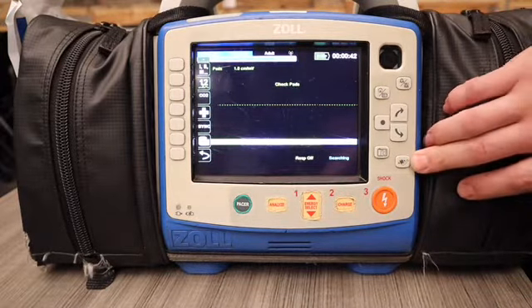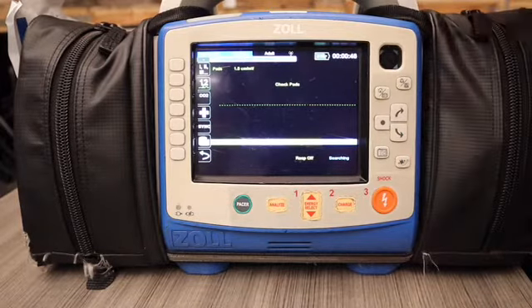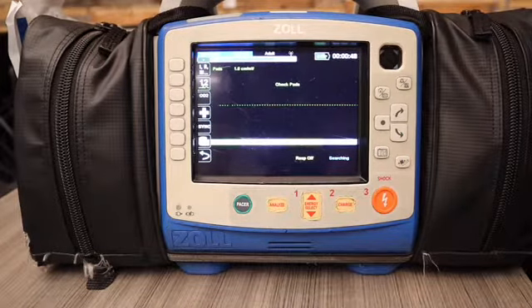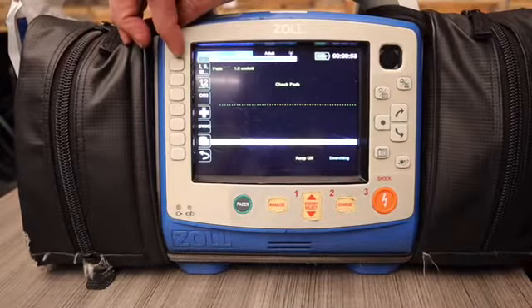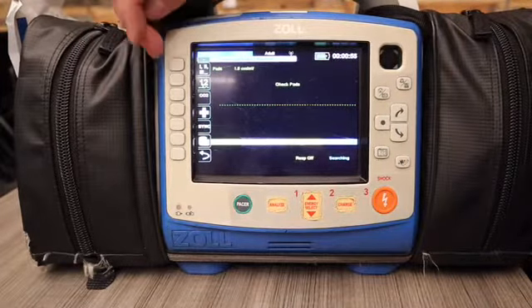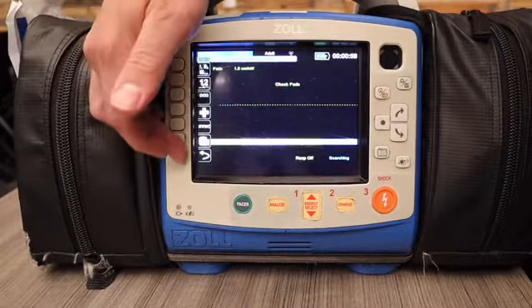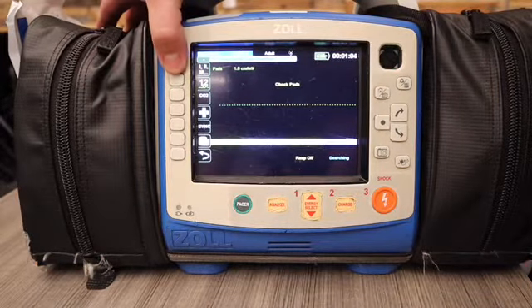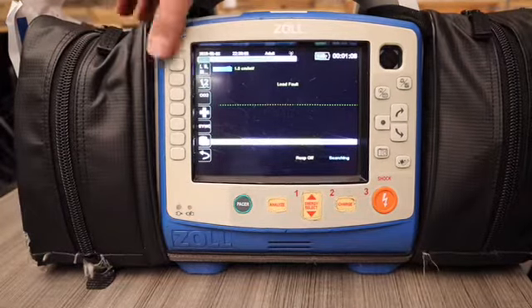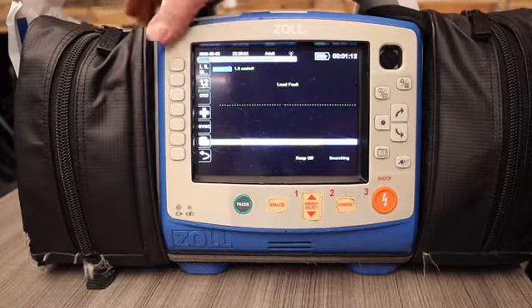Down here is our non-invasive blood pressure button, and the only function it does is operate the blood pressure cuff. On the left side of the monitor, we have a row of buttons. These ones are kind of fixed, but we can alternate between two different screens. The top one lets us select what leads we want to view — our four leads, or even if we have them on pads, we can toggle to that.